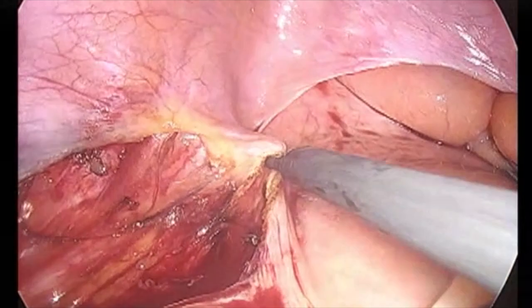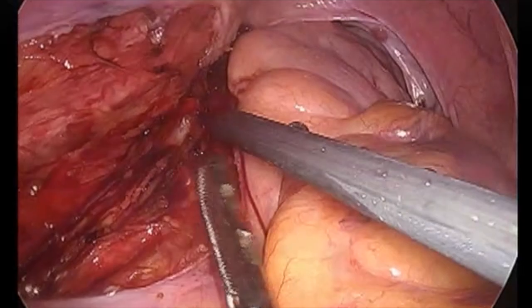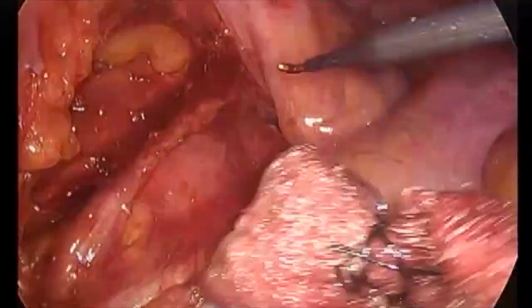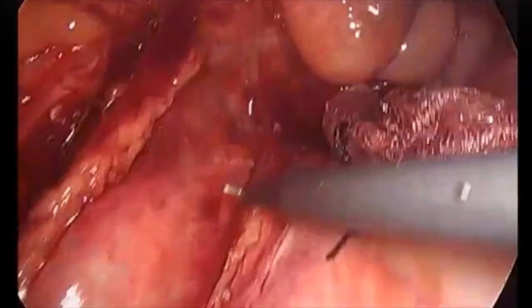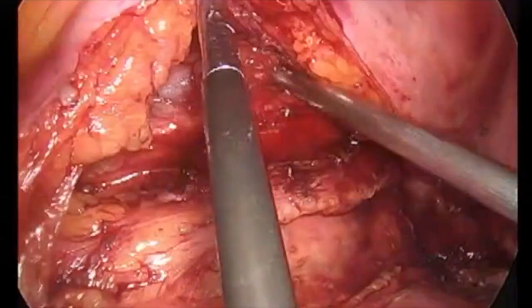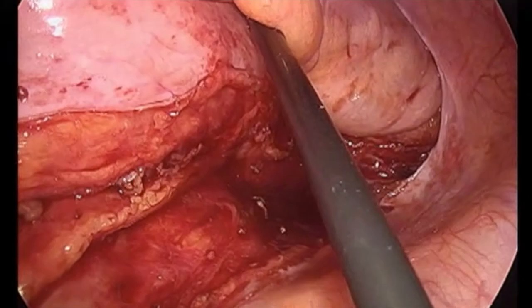Similar dissection is carried out on the left side as was performed on the right side. The left lateral ligaments of the rectum are divided. There's the iliac bifurcation, the sacral promontory, the coccyx and the pelvic diaphragm, and the psoas major muscle.